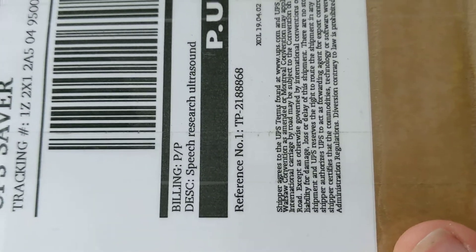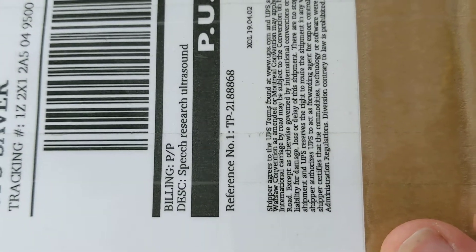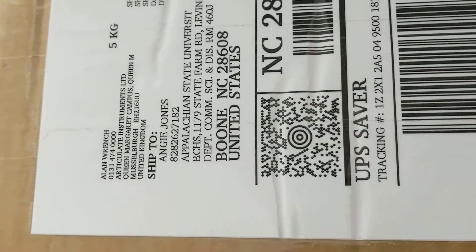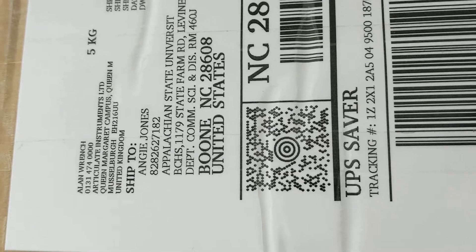Since unboxing videos are all the rage these days, look at that. We're going to take a look at a speech research ultrasound system from Alan Wrench at Articulate Instruments.